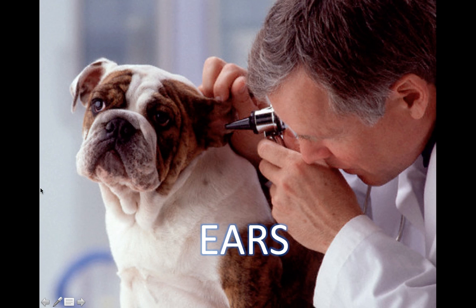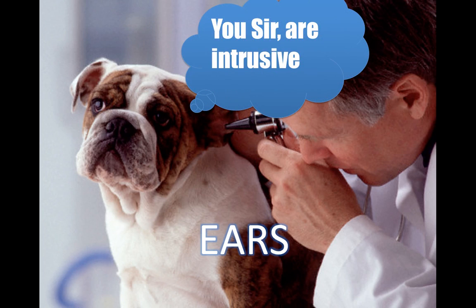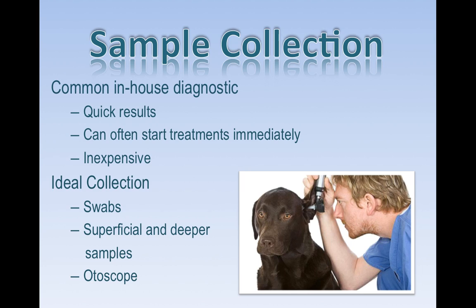Let's look at some ears in regard to cytology. Taking an ear swab is one of the most economic, affordable, and easy to do tests we can perform in-house for our patients. It's super common in-house with super quick results, and we can often start treatments immediately depending on what's found on the ear swab. It's inexpensive.